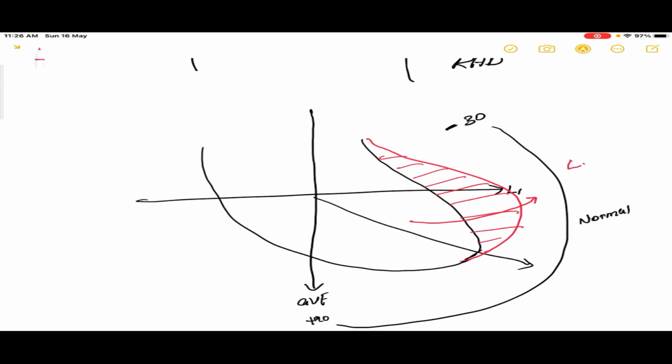In right ventricular hypertrophy, the right musculature of the heart is increased, producing increased activity in the right ventricle, towards the right side of the heart, producing right axis deviation. So this is why there is left axis and right axis deviation in hypertrophy.